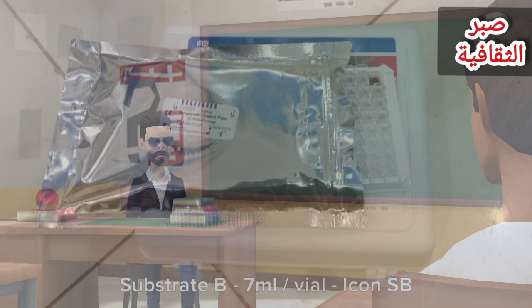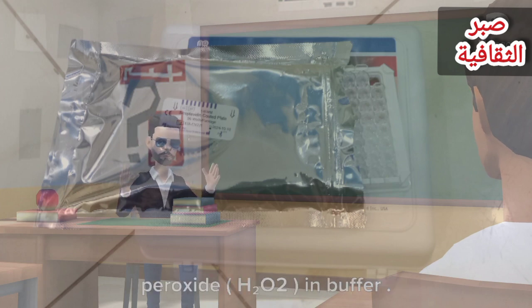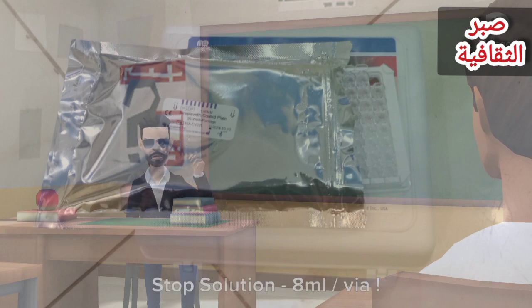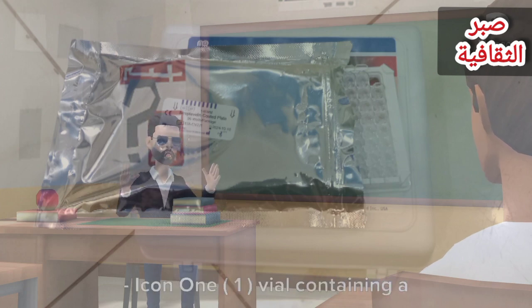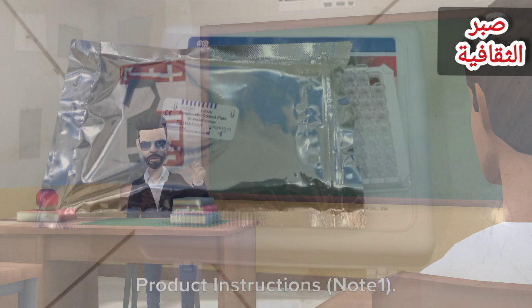F. Substrate B, 7 milliliters/vial. Icon SB: one vial containing hydrogen peroxide (H2O2) in buffer. Store at 2-8 degrees C. G. Stop solution, 8 milliliters/vial. Icon: one vial containing a strong acid, 1N HCl. Store at 2-8 degrees C. H. Product instructions.